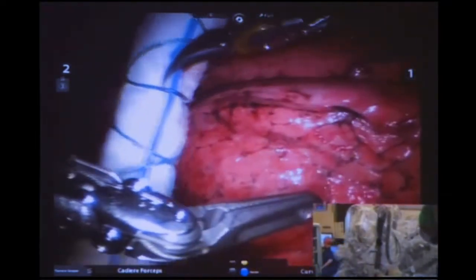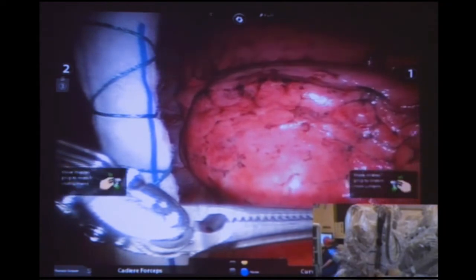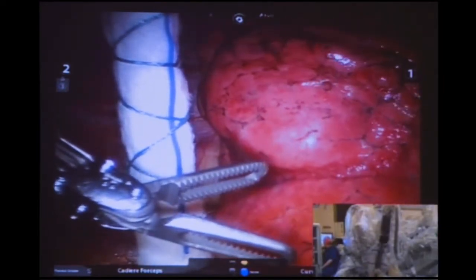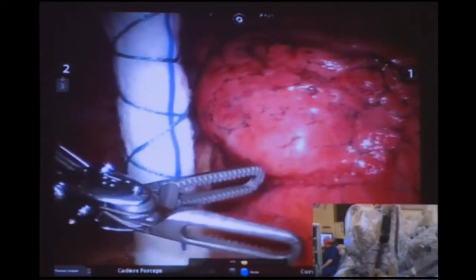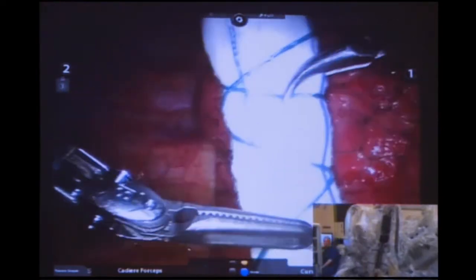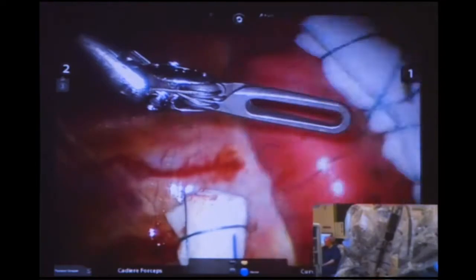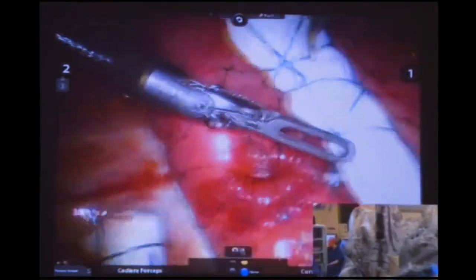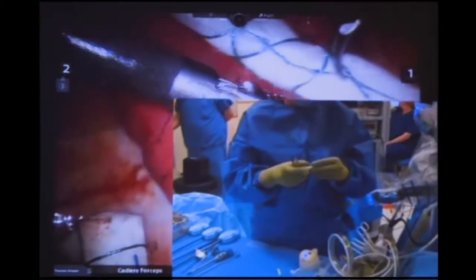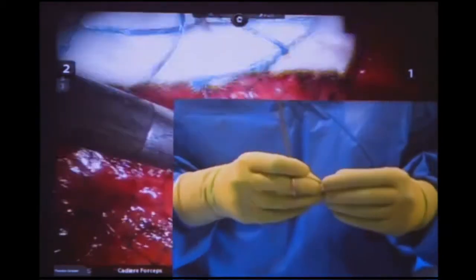Jean-Marc Bast calls them 'tapado' but I stick to 'surf cigars' — they're very useful if you have any bleeding. Lauren made them by taking a normal swab and suturing it — she's done a beautiful job while waiting for the patient. There are commercially manufactured ones you can get, but being nice to your scrub nurse works just as well. They're very useful in VATS — you can quickly grab them to push the lung away very delicately.